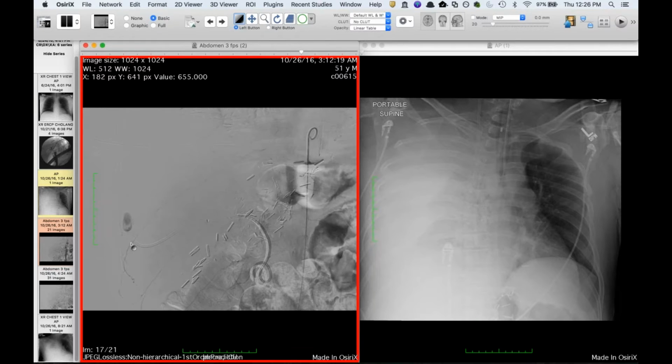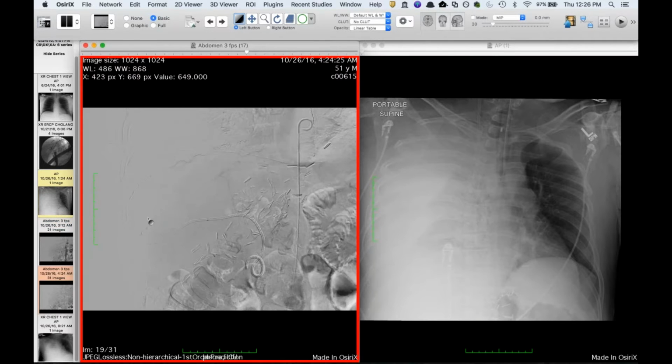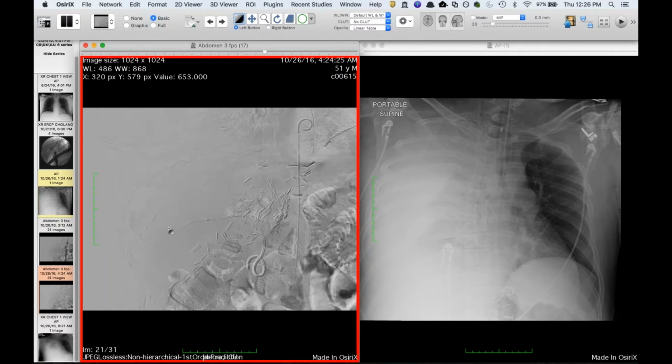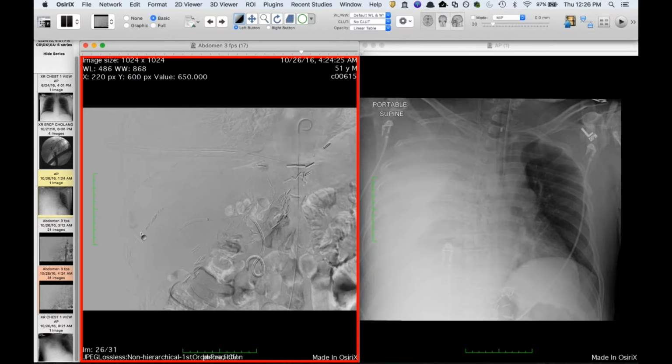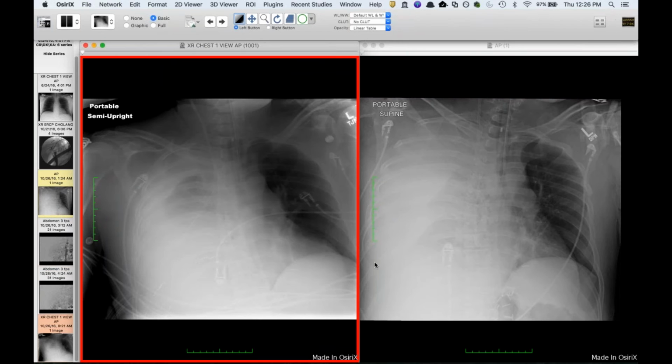And we were talking about this yesterday, that we always try to take care to avoid going right under a rib with our lung biopsies. Fortunately, we've never had complications, and I think it's just because we use a small needle relative to a big tube that you have to dilate in place. But this was the culprit vessel, and then they actually embolized two successive intercostal arteries, and there's still a tiny blush in here, but his hemothorax subsequently improved yesterday. So I thought it was a good example with the angiogram correlate of the active extravasation.